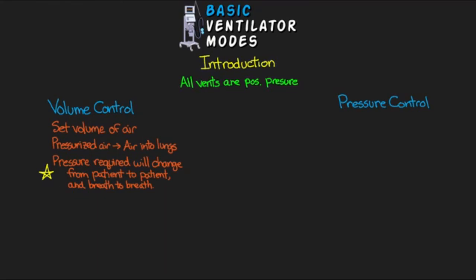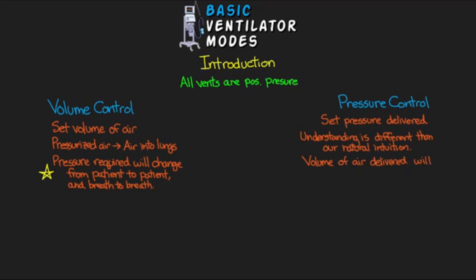So now if we move over and quickly talk about pressure control, here the reverse is taking place. In pressure control, we're going to be controlling the pressure that we deliver to our patients. There are many benefits to pressure control, which we are going to discuss in the next lesson on those advanced modes, but the thinking and understanding of these modes is different than our natural intuition. Similar to what we just talked about with volume control, depending on many factors, the volume of air, as opposed to the pressure of air, that is going to be delivered can and will change from patient to patient and breath to breath.